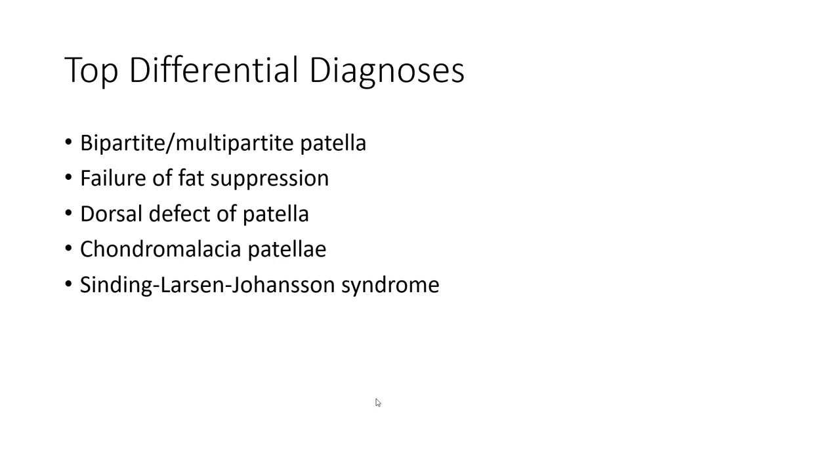Top differential diagnoses: bipartite patella, failure of fat suppression, dorsal defect of the patella, chondromalacia patella, and Sinding-Larsen-Johansson syndrome.